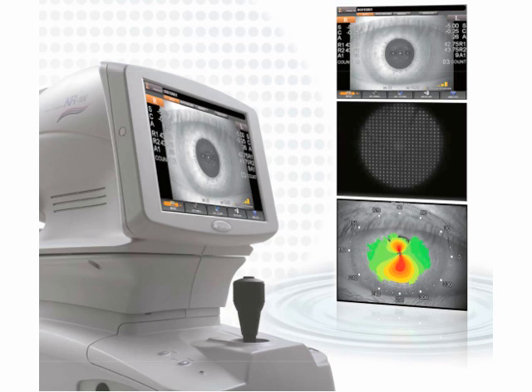This is an example of a commercial aberrometer. It's a Topcon aberrometer, and I know it shows topography on the bottom. That's fine. You can see the little dots shown in the middle slide on the right. Now, I don't know if those dots represent the cornea that's shown at the bottom, but if they do, then you get the sense, just as when we were trying to judge degree of cylinder with a placido disc, that you can't really look at an array of dots and derive from that, visually on your own, qualitatively what's going on with the wavefront, unless the distortion is just tremendous.